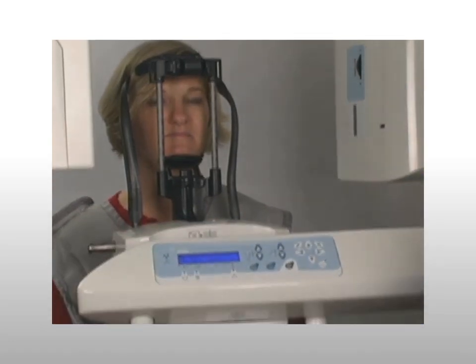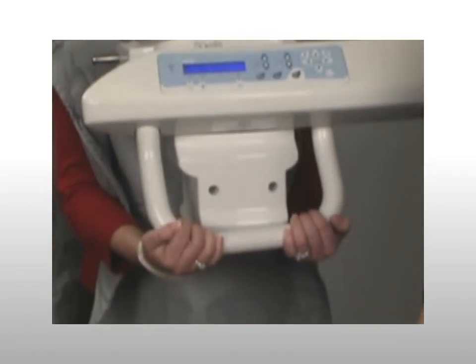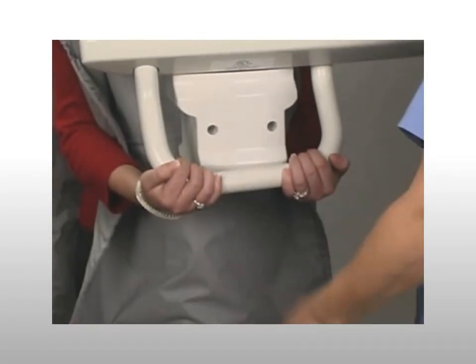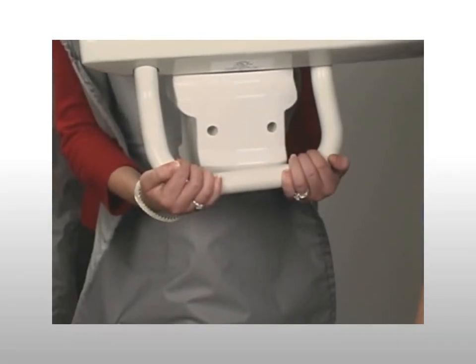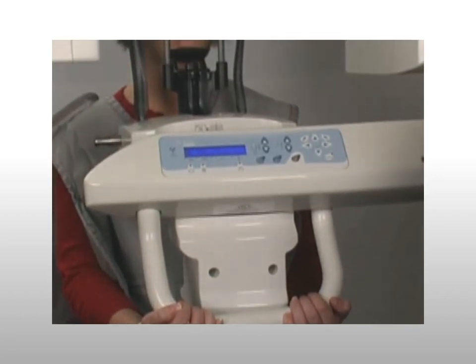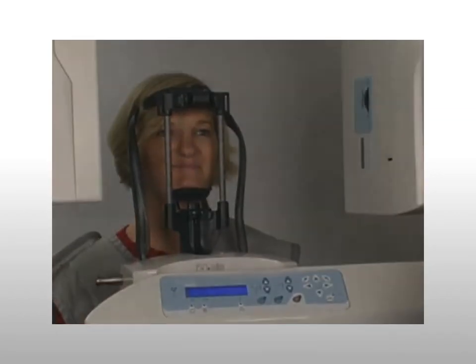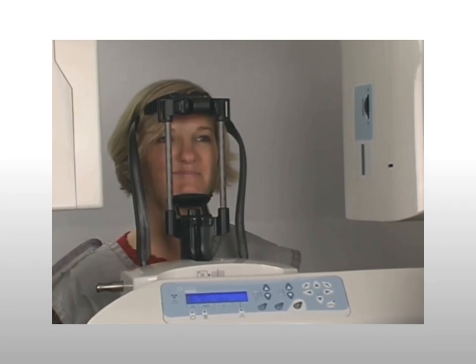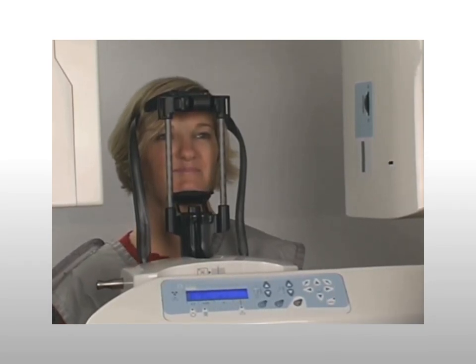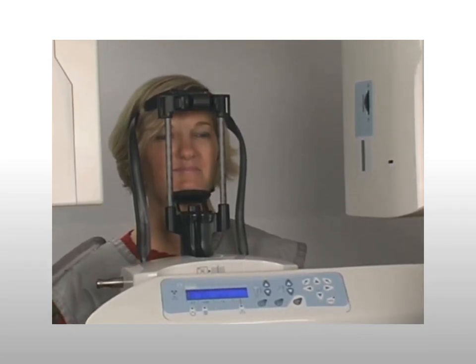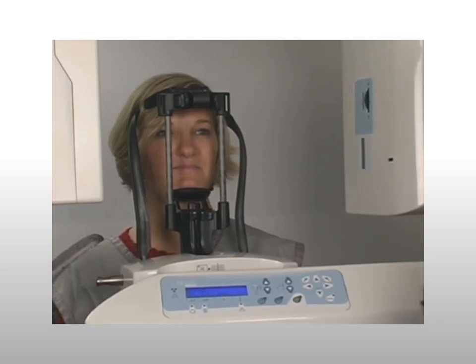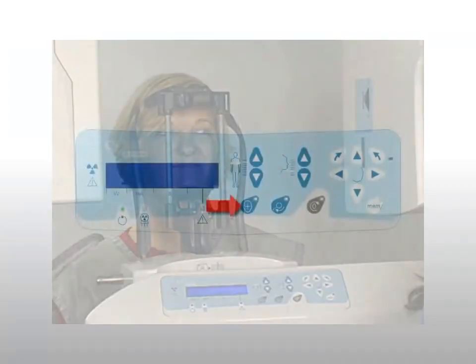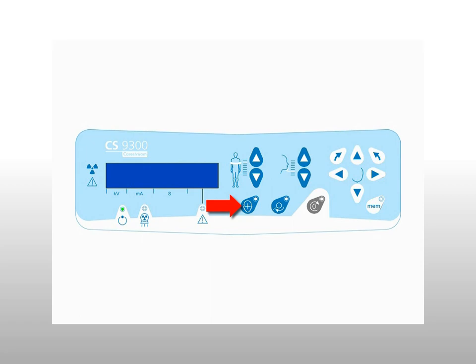Slowly close the temple supports to stabilize the patient's head. Next, instruct the patient to grip the lower handlebar underhanded. The underhanded grip relaxes and lowers the patient's shoulders, enabling clearance as the machine moves around the patient. Ask the patient to step forward and stand with both feet together. Explain the importance of keeping eyes closed to avoid exposure to the laser, then press the laser beam button to align the laser beams.